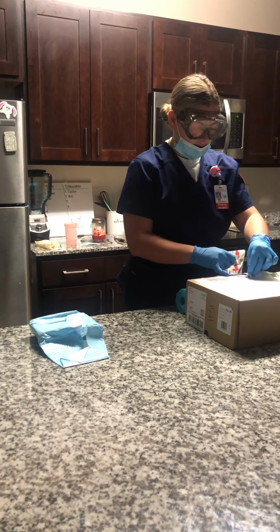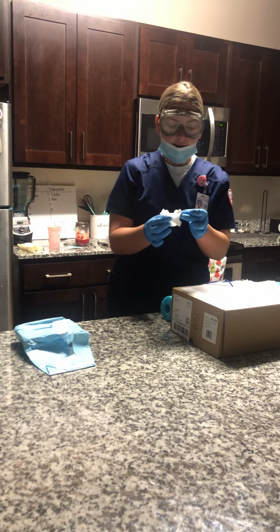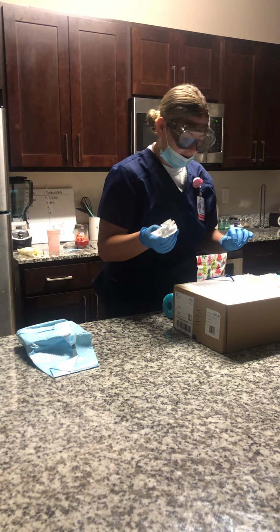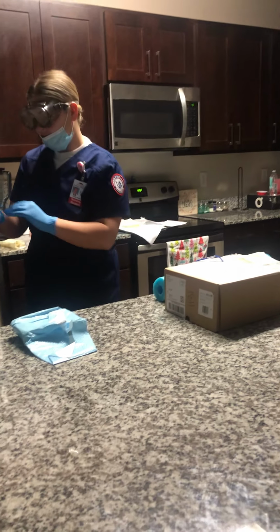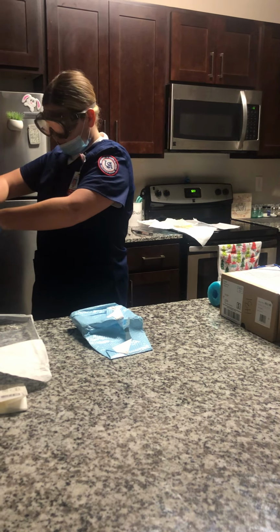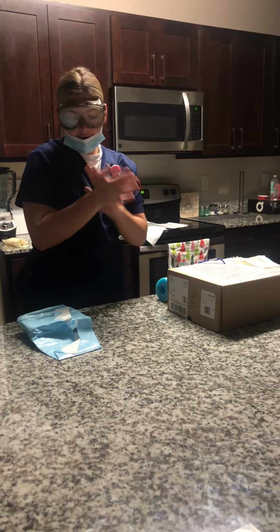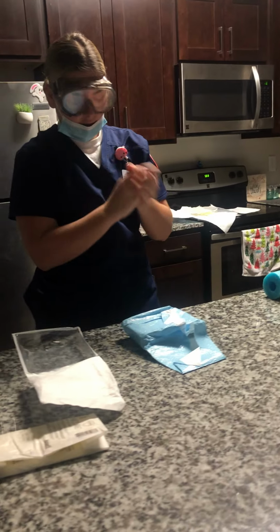I'm stabilizing the catheter. And I have his old bio patch. So now I'm looking for any signs and symptoms of complications, and I do want to note that I do not see any. So now I'm going to come over here, and I'm disposing the old stuff. So I did glove to glove, hand to hand. So now I'm going to perform hand hygiene, and I'm going to open this kit.